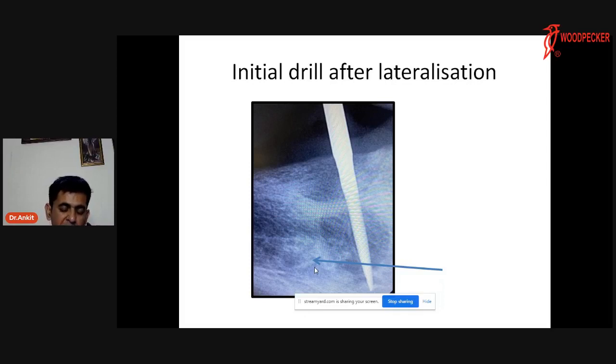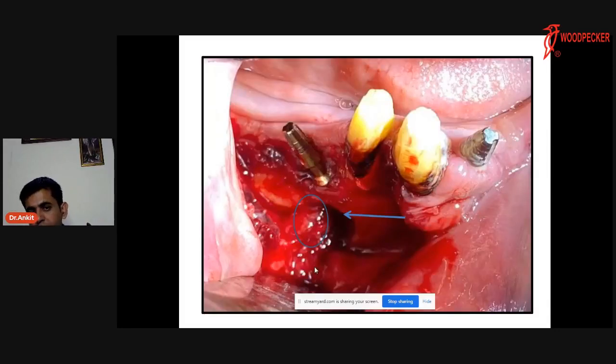And the very clear-cut advantage of the piezotome over other conventional burs, techniques and saws is that piezoelectric use is a safer option, because we know in such scenarios where the nerve needs to be displaced, even a slight movement of the patient here and there can lead to iatrogenic slipping of our instrument, and serious complications which I have already discussed, neurosensory deficit from grade 1 to grade 4, might occur, and the inferior alveolar nerve might get damaged. Okay, so what we want is free and clear access to the nerve. So in such a scenario, we need to be very clear, right? In fact, studies have shown that the negative side effects become much higher if a rotating instrument comes in contact with the nerve.